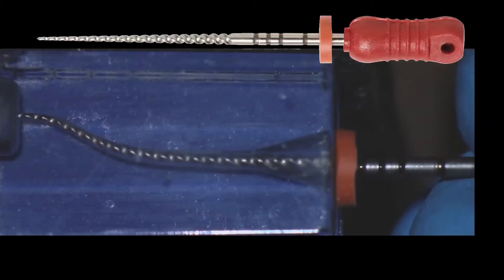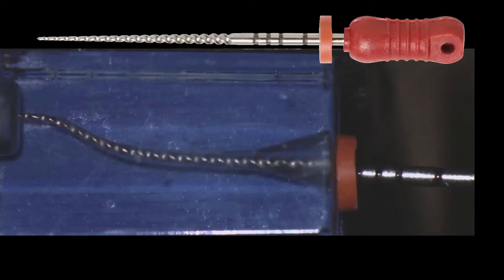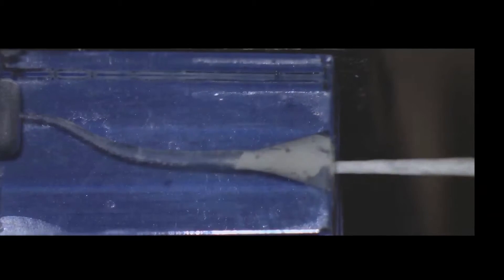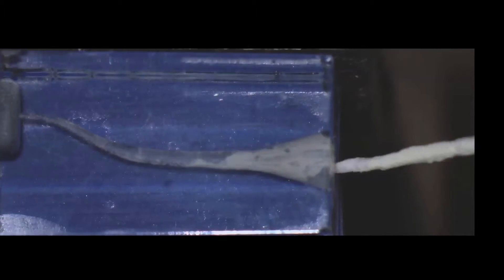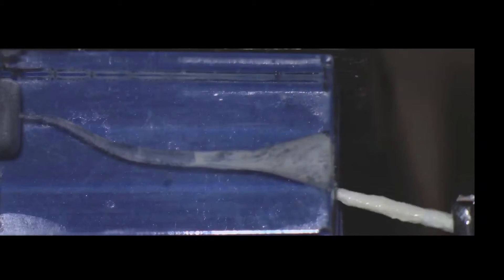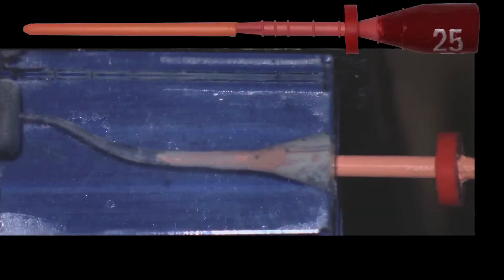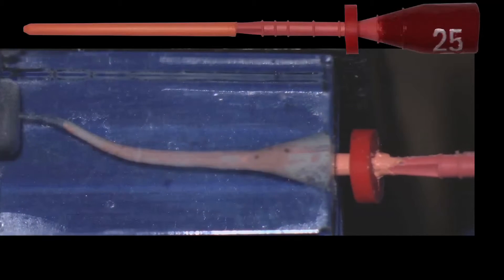Now we verify with a size verifier that there is sufficient space in the canal to receive our core material for obturation. We dry the canals very well. After drying, we place cement at the entrance of the canal and remove the excess — it must be a very fine layer of cement. Then we insert the core obturator of the appropriate taper until it reaches working length. You have seen how easy it is to fill the canals, in this case, with gutta-percha.